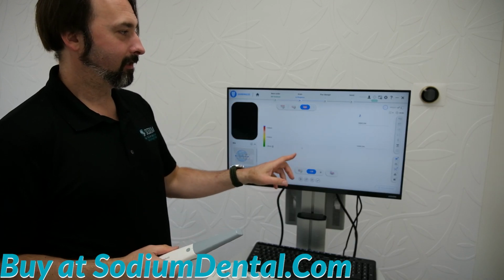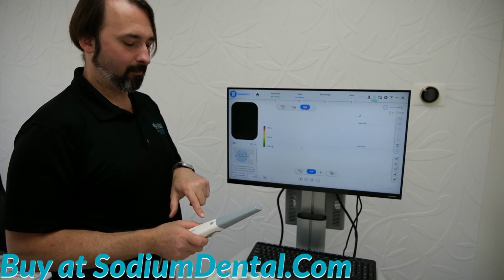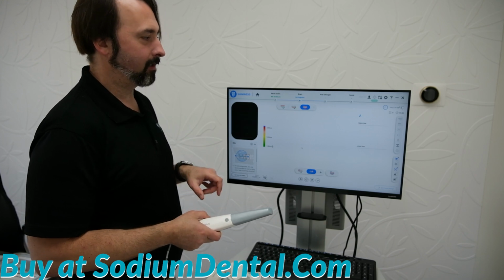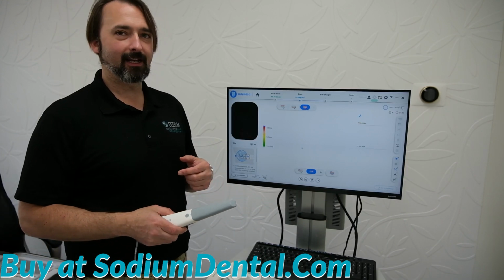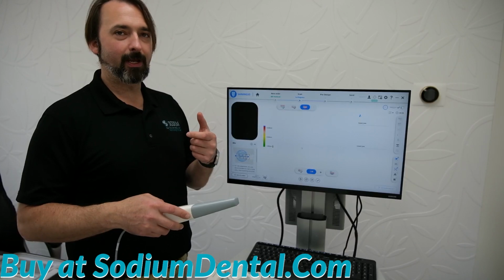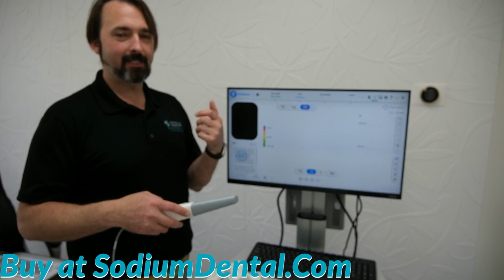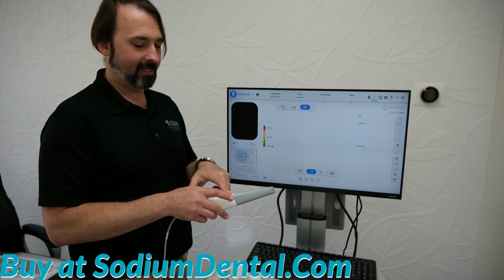When both jaws come together, while the patient is still biting, press the scan button to pause it and finish that side bite scan. Now, do it again on the left side. Insert the scanner into the patient's left buccal space, ask them to bite down fully and stay, then engage the scan.